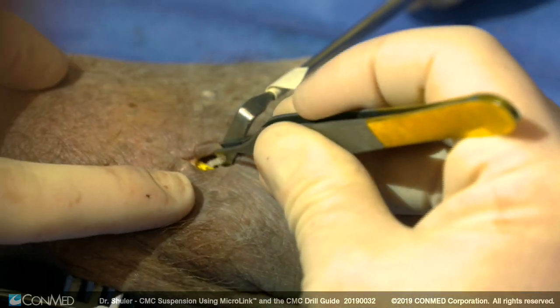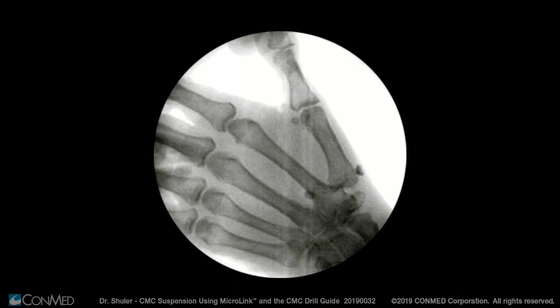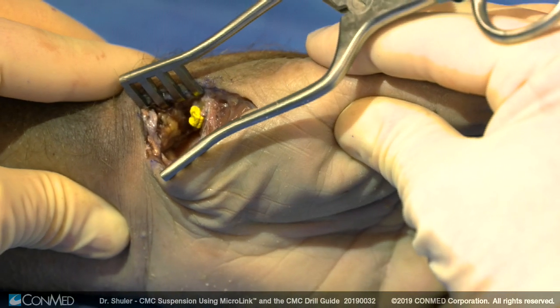A minimum of five throws plus four additional throws is required to ensure fixation of the micro link system. However, additional throws up to ten total can be helpful in burying the knot at the trapeziectomy site. Obtain fluoroscopy to ensure one to two millimeters of separation between the index and thumb metacarpal exists prior to stabilizing and throwing the sutures.